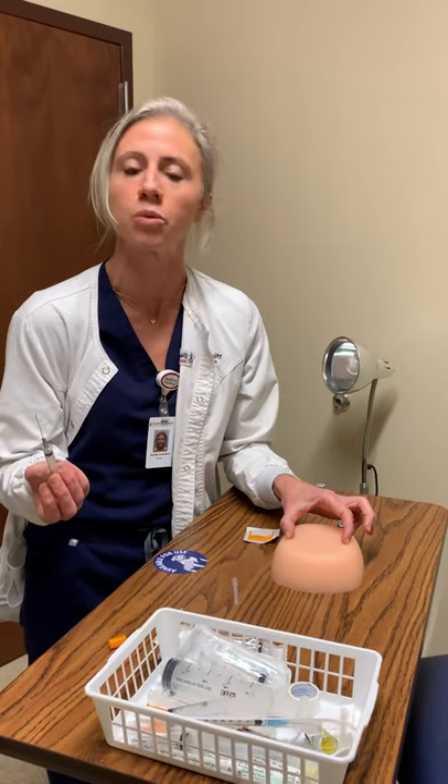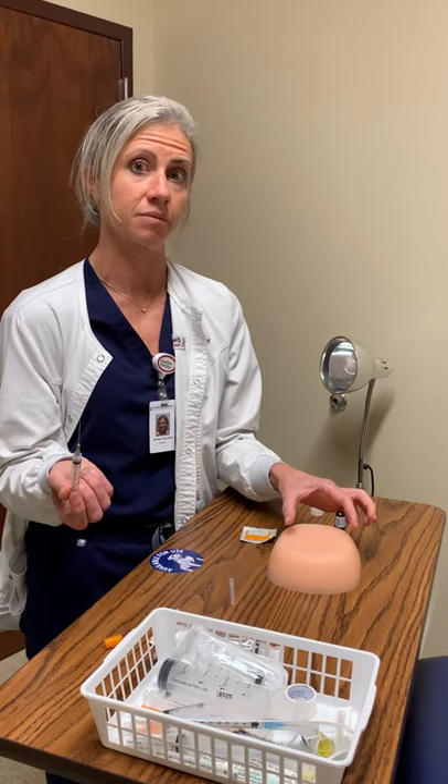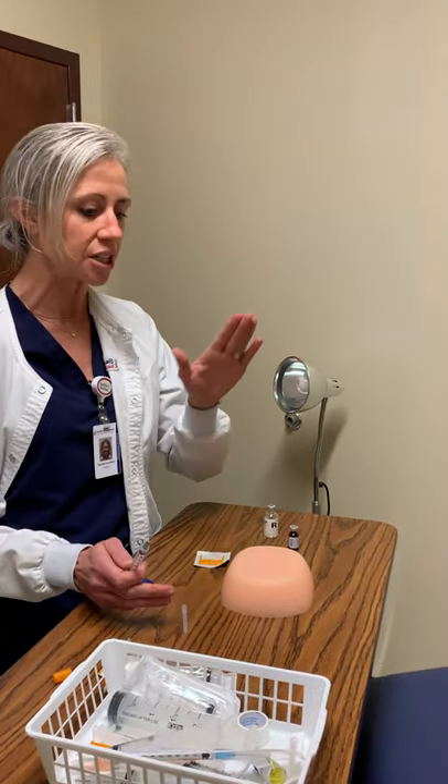If your needle is bigger — for instance, a 21-gauge for something thick like testosterone — the patient might bleed a little bit. Or if the patient is on a blood thinner, always have some gauze in the room just in case, because bleeding can make the patient feel bad after getting a shot. Put gauze on the site, hold a little pressure, then get your band-aid on. Assess that they're feeling okay, and dispose of the needle in the sharps container. Clean up, assess your patient, and make sure they're doing okay before you leave the room.